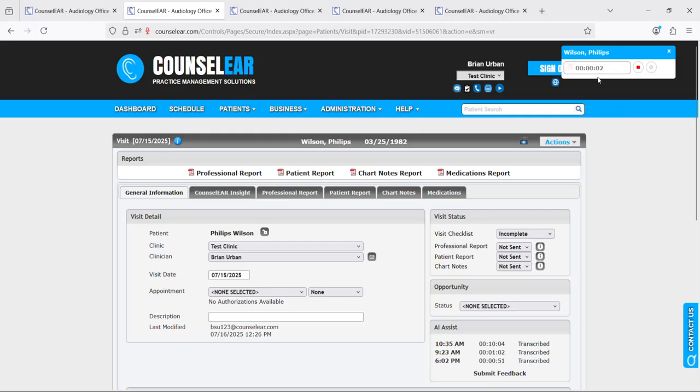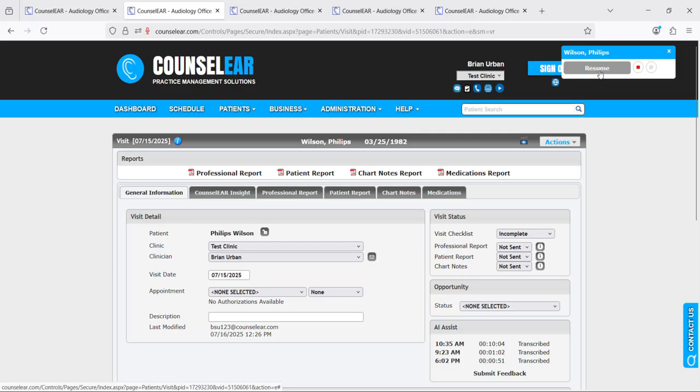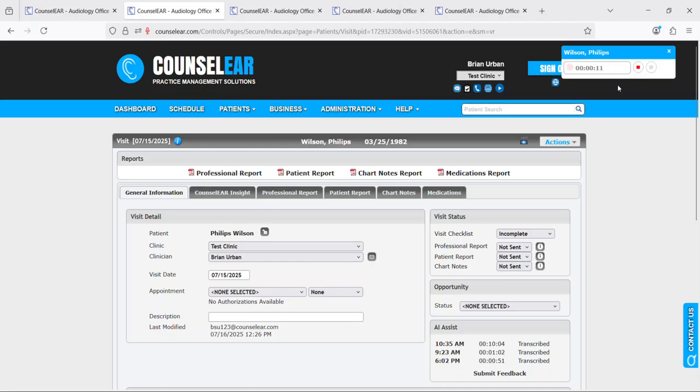Now as we can see the counter is starting. When I hover it will show pause. If I wish to pause, simply click pause. If I wish to restart, go ahead and resume. When I want to finish, then we just choose the stop and save option.